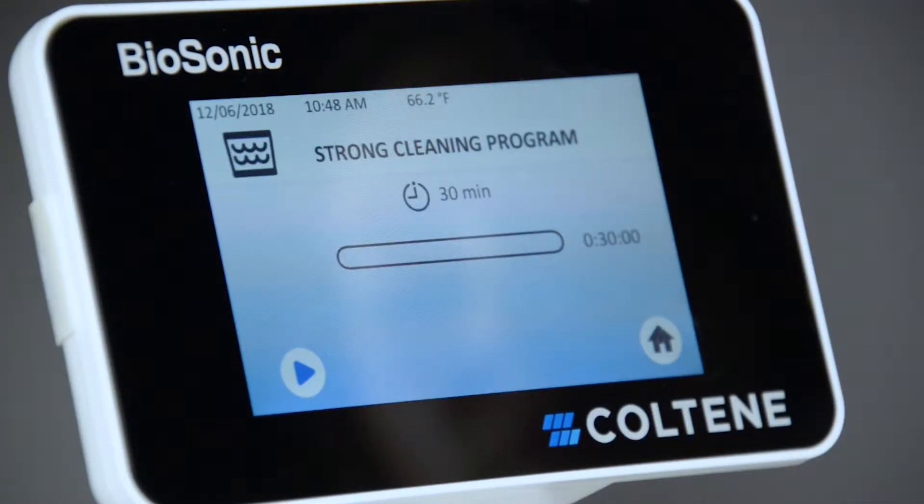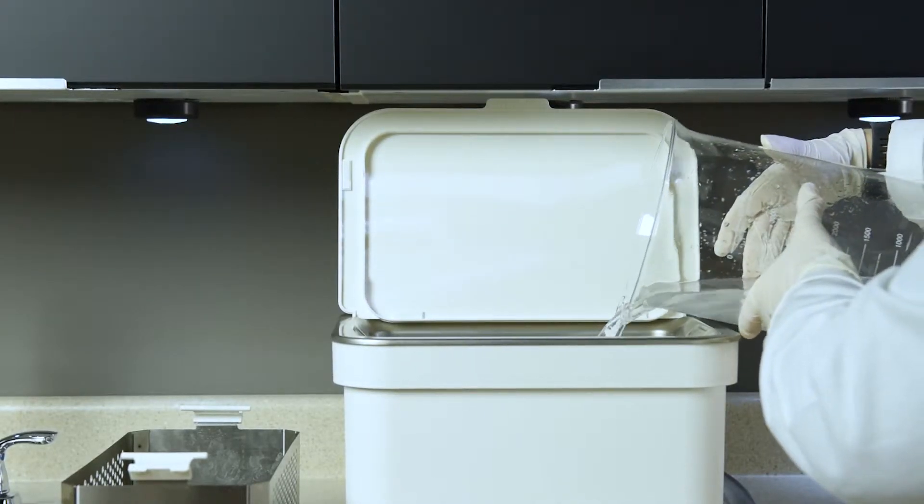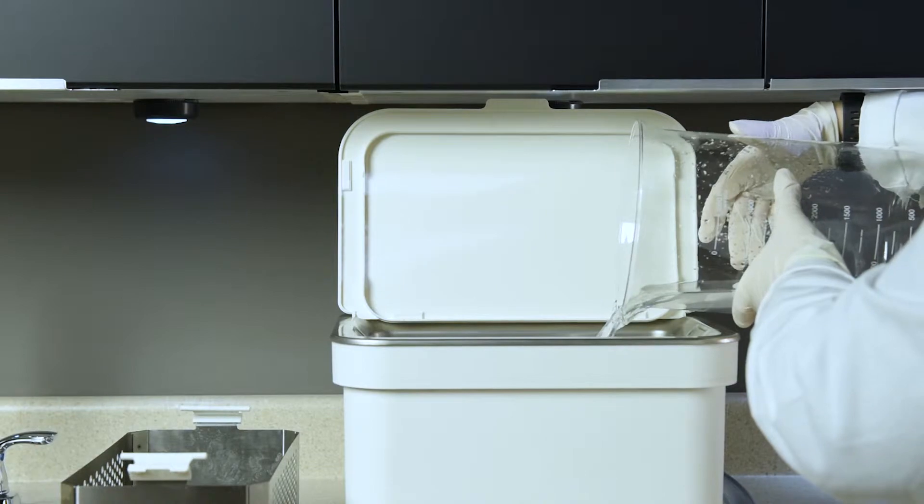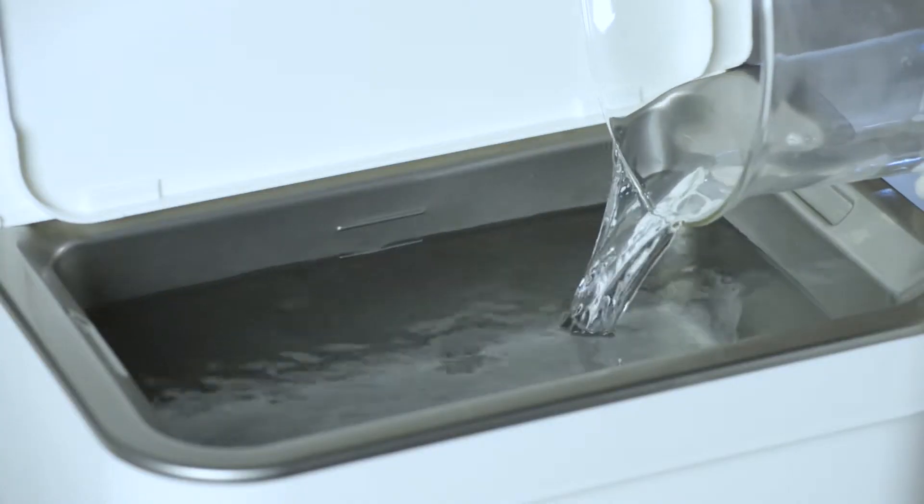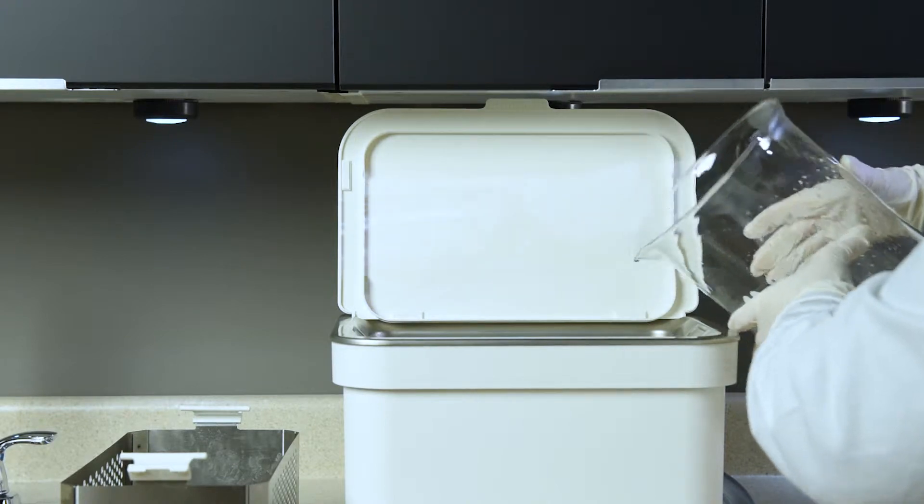Type of water: not all water is the same and may vary in level of contaminants and hardness, which can affect the level of cavitation in the solution. This can increase or decrease the time of a cleaning cycle.